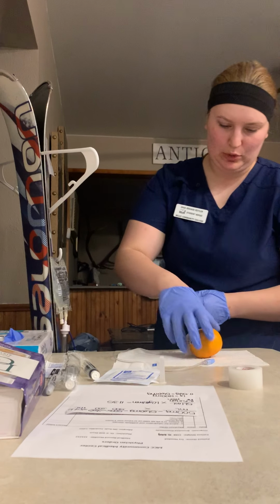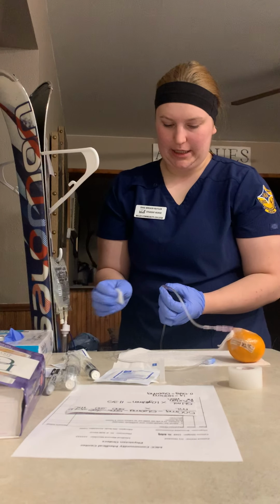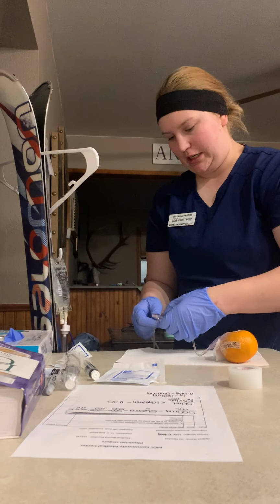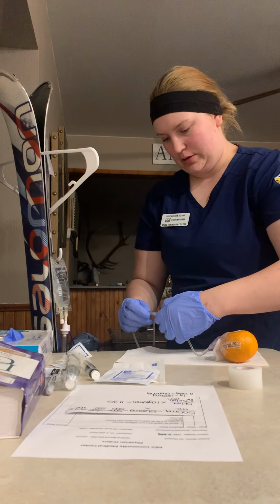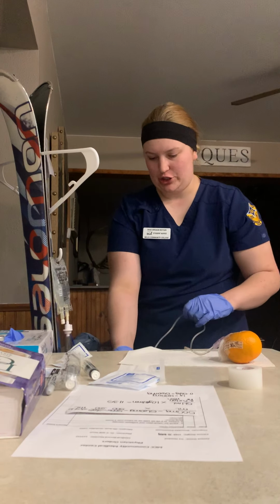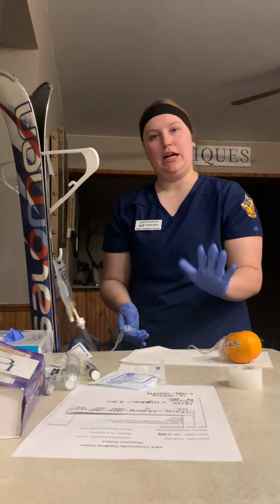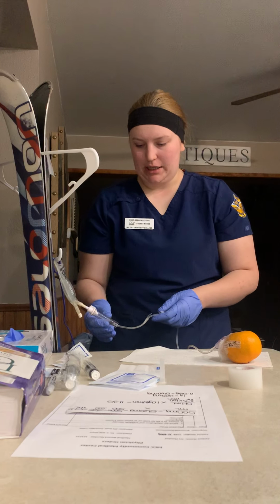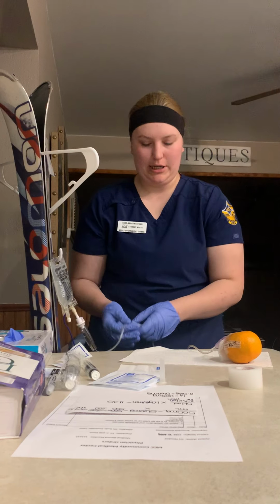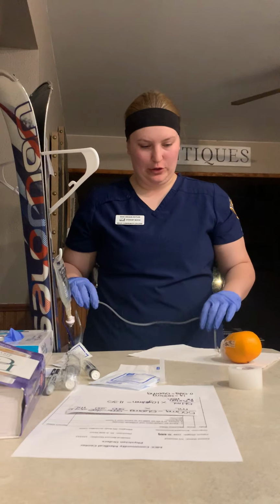And we'll use this first port here. Making sure you clean that off. And then we can hook up our piggyback line. And then adjust your piggyback to where it needs to be. And I forgot, I'm gonna go back. When I hooked up my line, I should have filled this halfway. I apologize, but I knew I should have done that. So now I'm gonna adjust it, and will be infusing into my patient.